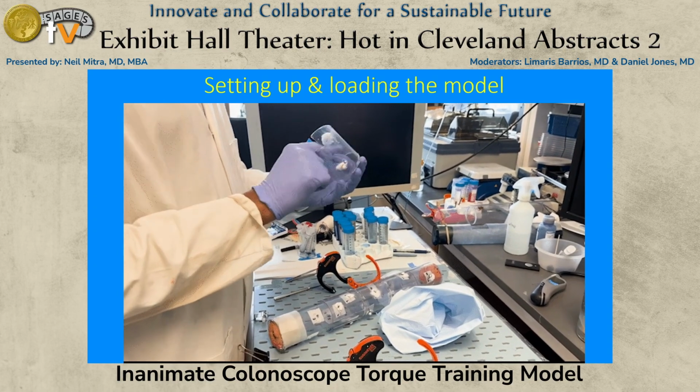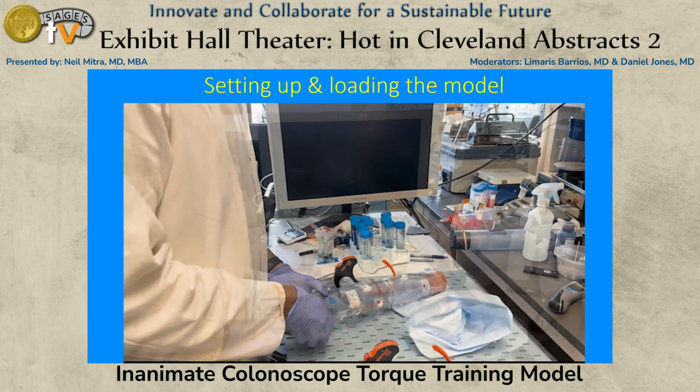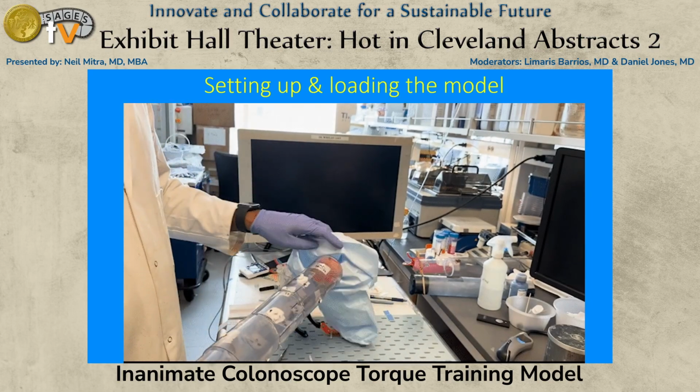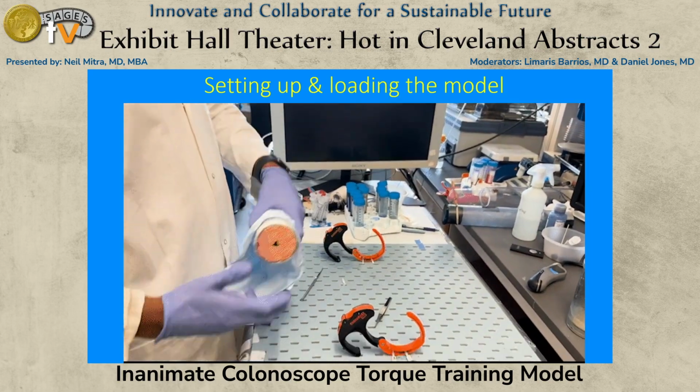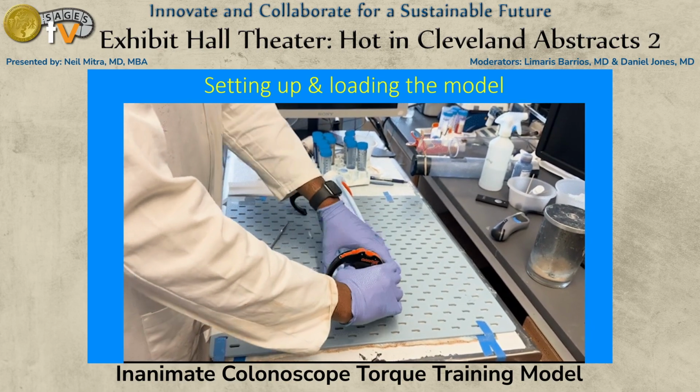Here we see small pieces of cotton being placed over each of the tube's holes. Next, numerous 2 to 3 inch long plastic oversleeves are placed along the tube to stabilize and compress the cotton plugs. After loading the tube, it is mounted onto a pegboard held in place by vice grips. Round sponges, one of which is slitted, are placed on each end, as mentioned before.